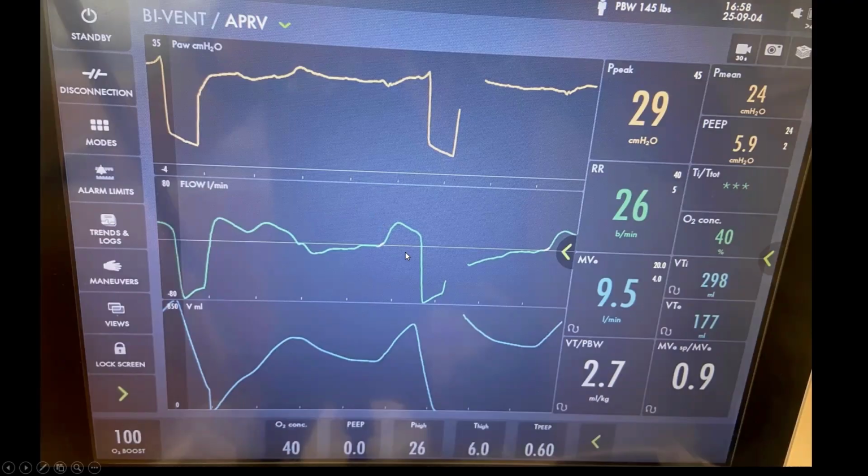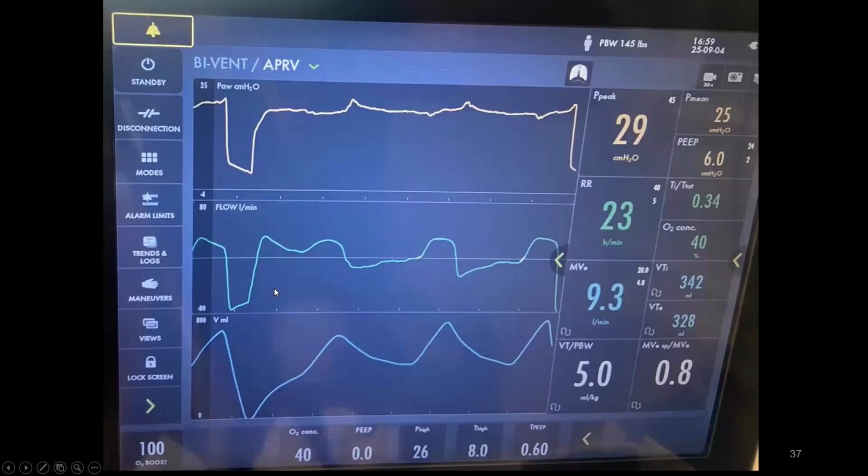Let's see, one of the time high, and this is set at 6 seconds. And you think, wow, 6 seconds is really long, but technically it's not. If you have a 1 to 3 normal I:E ratio, and you go 1 to 3 and 1 to 3, that's at 6. You can't even get 2 breaths in that. That's another way to think about it. So I made the recommendation. I said, just stretch out the time high from 6 out to 8 seconds. Don't make any other changes, just take it. And then wait a few minutes.